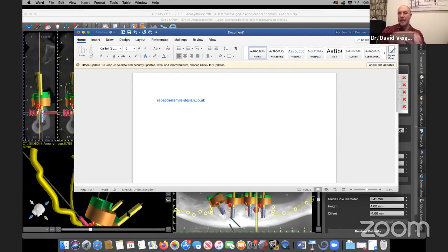I then take that off. I trim all the excess resin away, trim all the excess temporary away that I don't want, close my surgical site, and then deliver the temporary immediate load. Or close the surgical site before the pickup, whatever way, just as long as the surgical site is closed first. Okay.